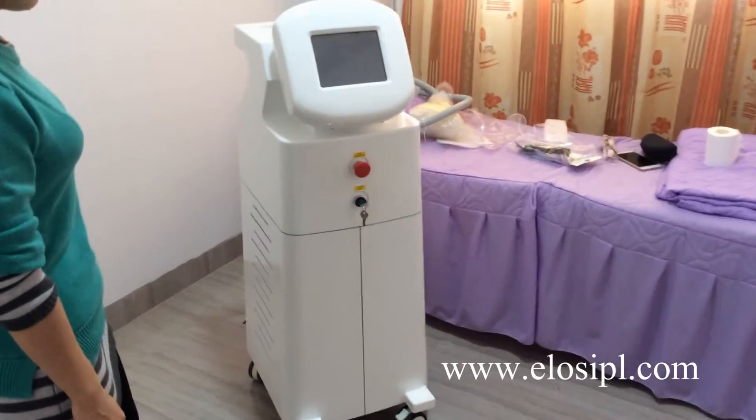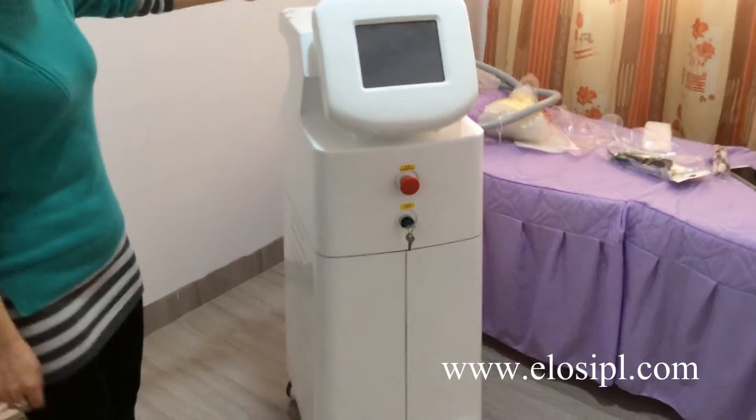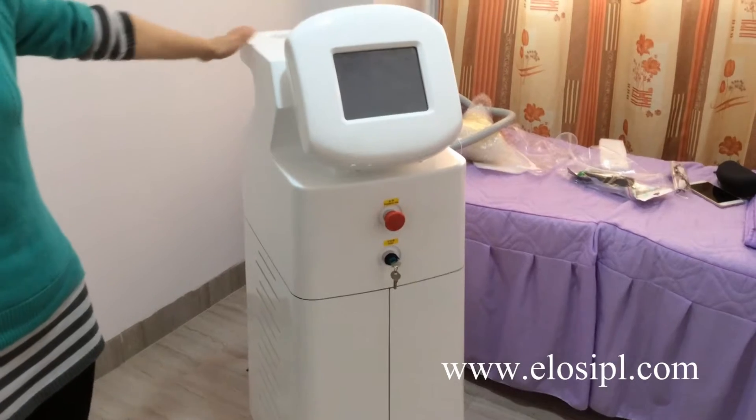Allis 808 Nanometer direct laser hair removal machine. Take out the machine and all accessories from the package.